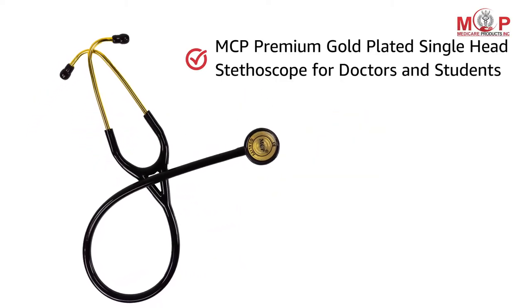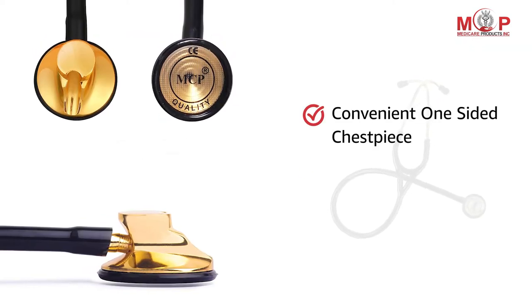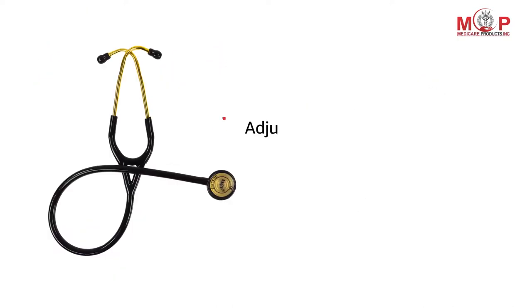Presenting MCP Premium Gold Plated Single Head Stethoscope for doctors and students. This stethoscope has a classy and stylish design with a convenient one-sided chest piece.